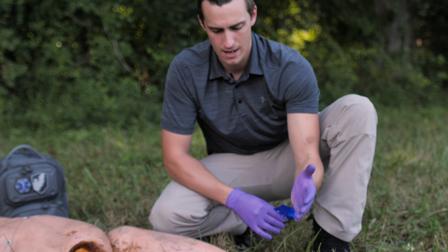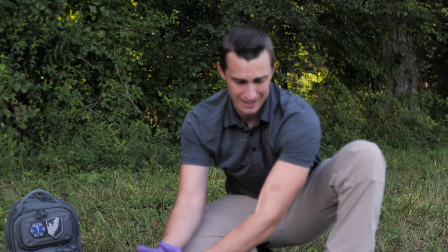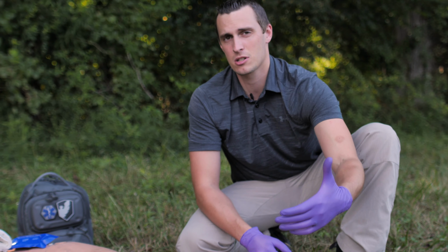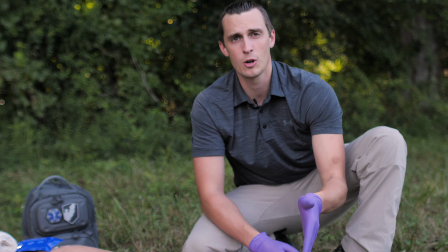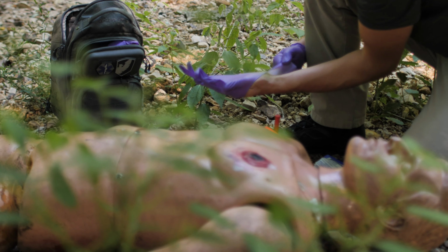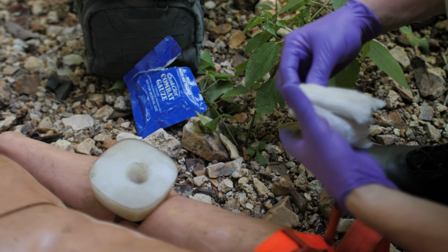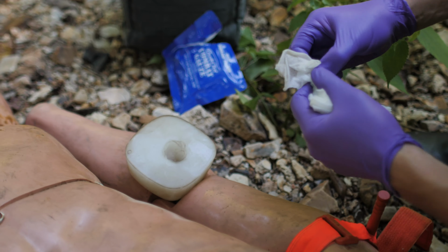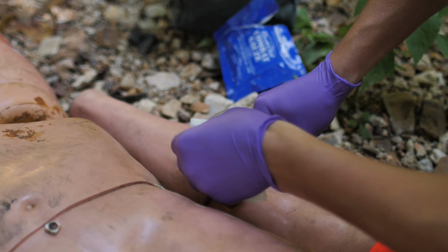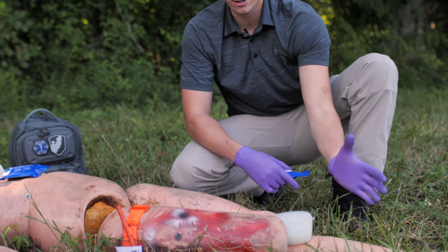We get to the C. We are now at circulation. We're reassessing the tourniquet. The tourniquet is tight enough, but we believe that there's going to be an extended time to get him to surgery, and we have a wound that we think we can wound pack, transition this over, and we'll be able to monitor this patient so in case something goes wrong, we can now pay attention to this and we can address it. So we feel that this is a safe time to do a tourniquet conversion, so we're going to go ahead and do that. So we will expose the site. Let's assume that's already exposed.